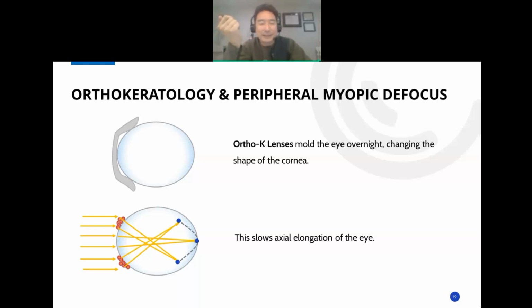But the newer theory nowadays is called intracellular fluid exchange. The cells in the central part of your cornea get dehydrated like a raisin, and on the periphery they swell up like a grape. So there's no cell redistribution, but rather redistribution of intracellular fluids. The whole idea at the end of the day is that you make the cornea flatter, and the center will be focused on the macula, but the peripheral rays will be focused in front of the retina.